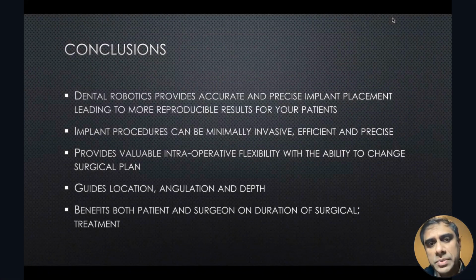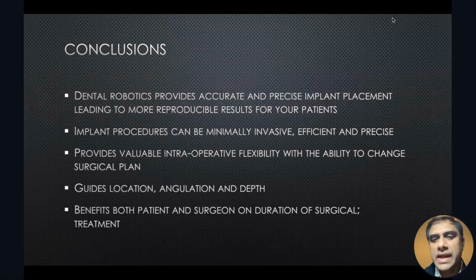Why robotics? Because of this accuracy and precise implant placements, minimally invasive, very efficient and precise. It helps in proper planning on the location, angulation, depth, etc. And it just benefits overall patient experience and outcomes, treatment outcomes, and just less complications, which is exactly what we want as we start to provide all this different complex care that we do.